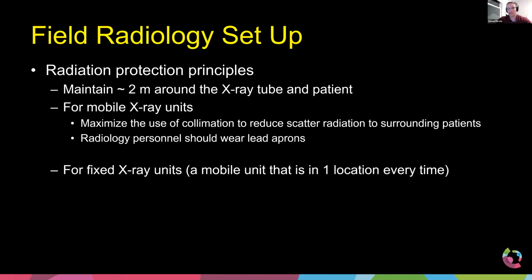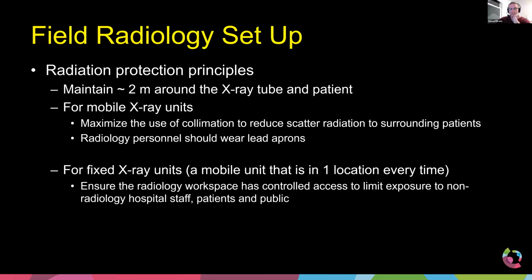Now, there are cases, and some of my colleagues in other hospitals did this, where they set up the tent and there was one room basically for X-ray. It was a portable system set up, and the system was stationary. They would bring the patients either on wheelchair or in their bed up to that location, up to a wall. They would image through, and then the patient would leave. So we're talking about a quote unquote fixed unit, even though it's a mobile system.